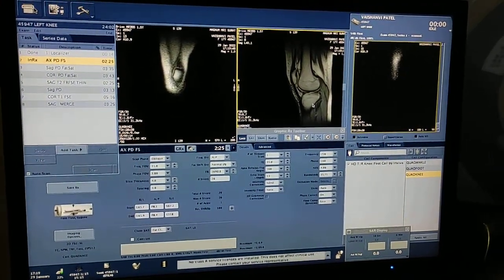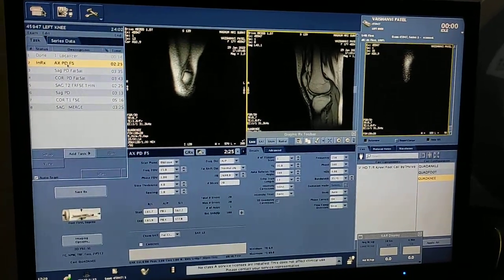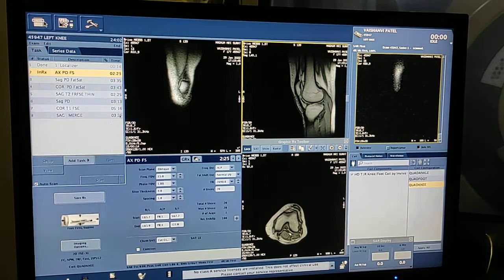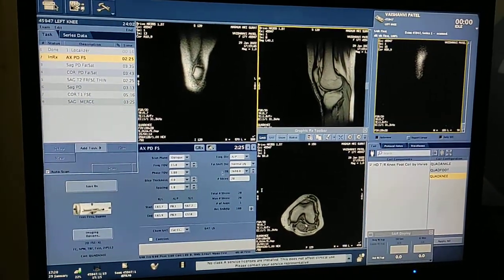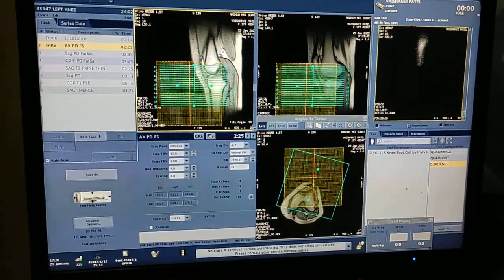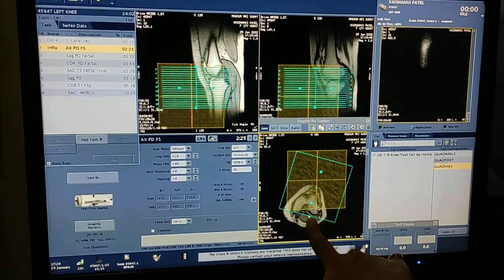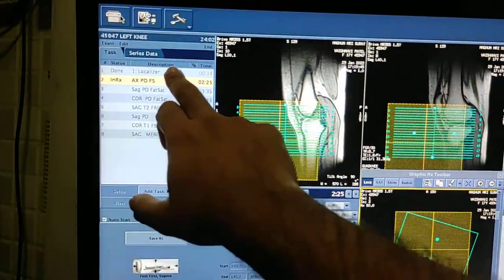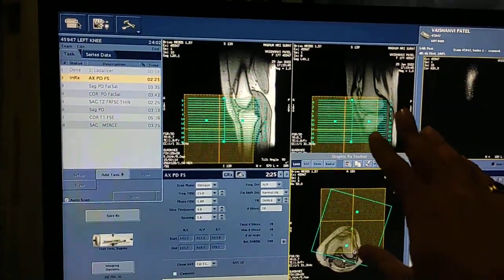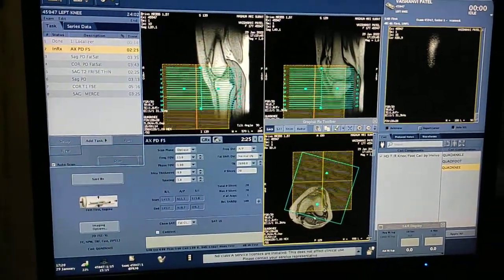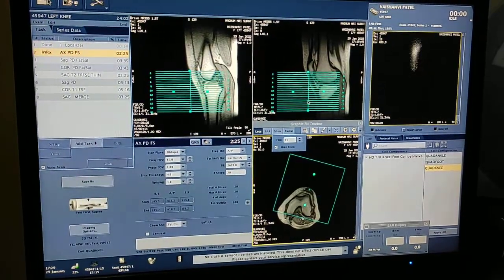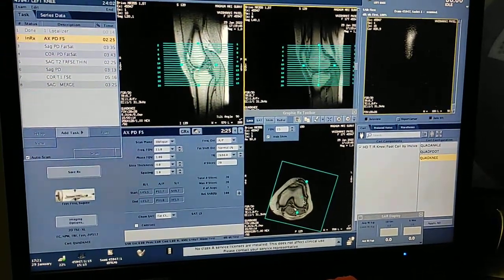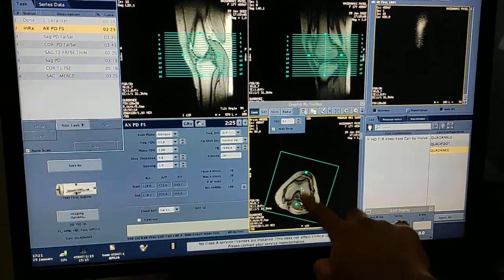The three-plane localizer has now displayed. First of all, I am going to take the axial image, and after generating the axial image I will plan the rest of the sequences. Note that the angulation of the axial image is slightly tilted — that doesn't matter. If you want a straight localizer, simply select the localizer, copy and paste, double click to open, and you can re-localize.